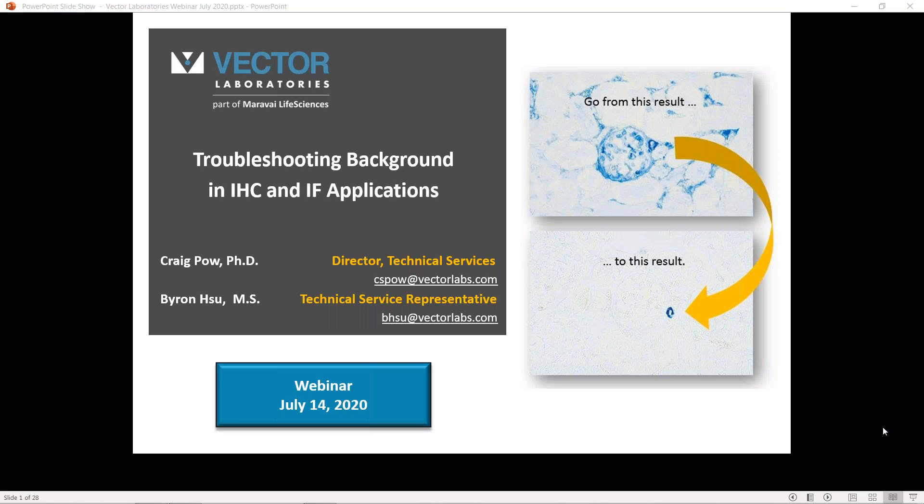Hi. Thank you for joining us today for our first webinar. This is a series that focuses on improving immunohistochemistry and immunofluorescence workflows. Today's webinar is about troubleshooting IHC and IF backgrounds. This will be presented by my colleague Dr. Craig Powell. Following the 20-minute presentation, we will have a 10-minute Q&A session.